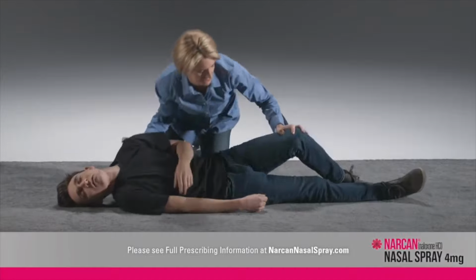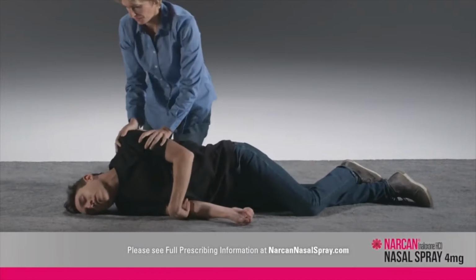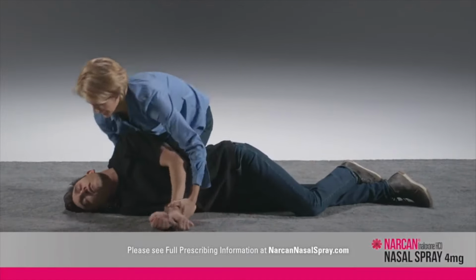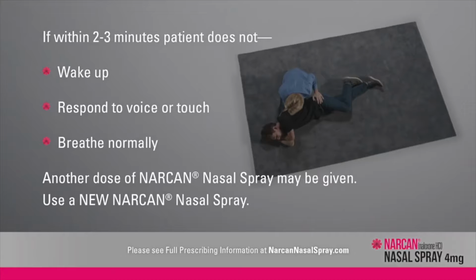Move the person on their side after giving NARCAN nasal spray. If possible, put their hands under their head and bend their upper leg forward. This helps prevent the person from rolling onto their stomach. This is known as the recovery position. Continue to watch the person closely. If they do not wake up or respond to your voice or touch, or if they do not seem to be breathing normally within 2 to 3 minutes, use a new NARCAN nasal spray to give an additional dose in the other nostril.